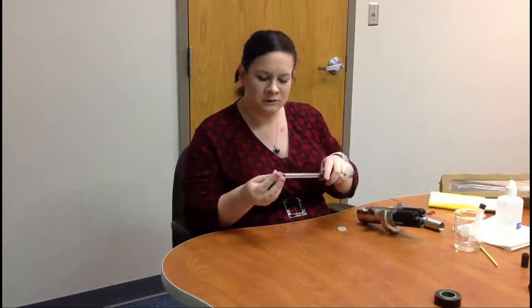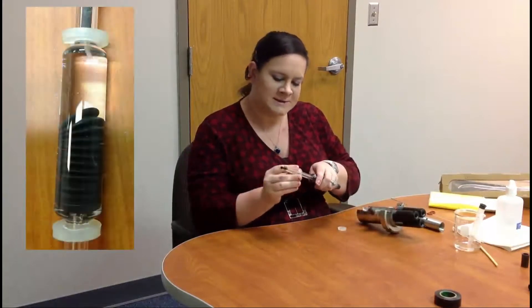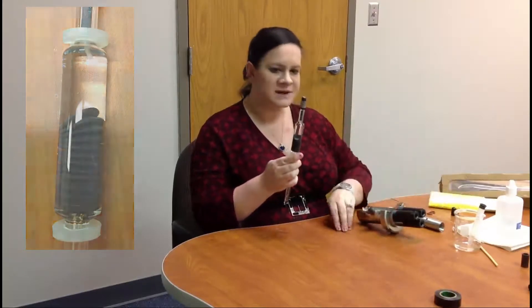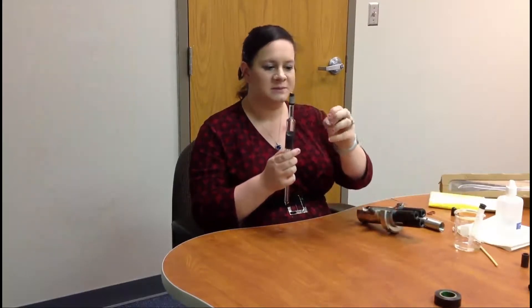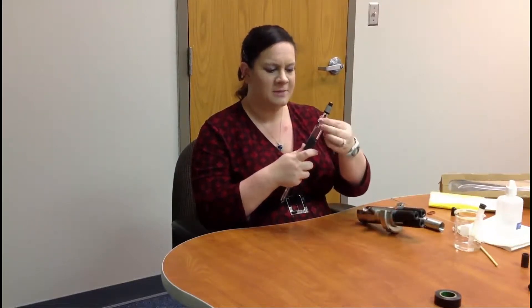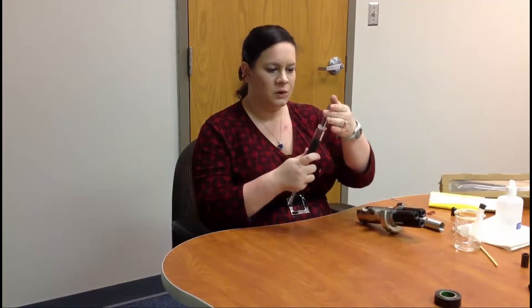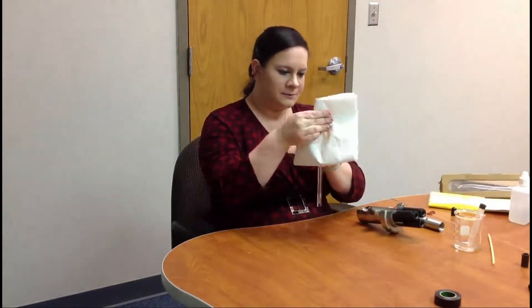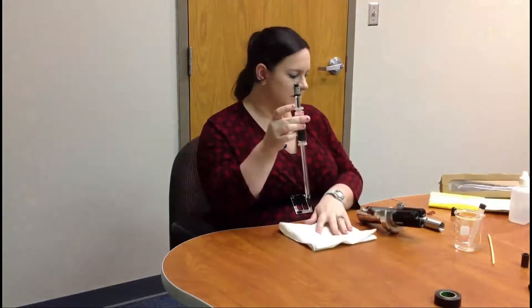Take the two little rubber O-rings and place them on the sensor — one goes on the bottom, one goes on the top. You can either slide it over, or most people end up cutting it to make it a little easier because it's a tight fit up over the cap, or you can undo the cap, slide it on, and put the cap back on either way.